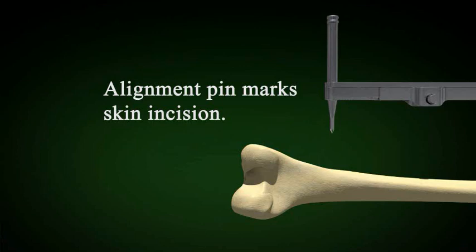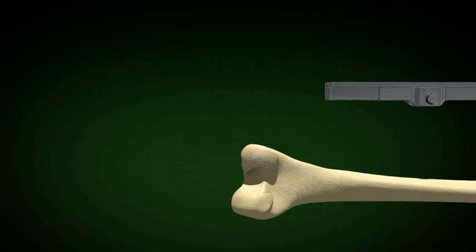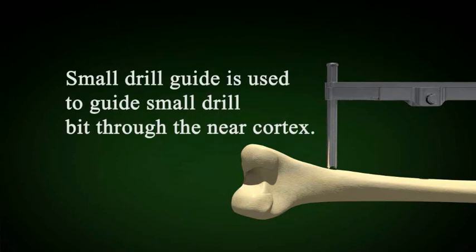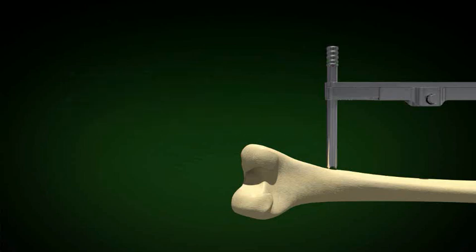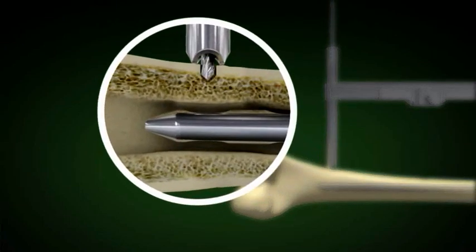The distal interlocking is done by first making an indent into the skin where you intend to make the skin incision. The incision is carried down to the bone and all soft tissue is removed from the bone. The cannula is then inserted directly on the bone — do not hammer the cannula. The small drill guide is placed through the cannula and the pilot hole is driven through the near cortex.